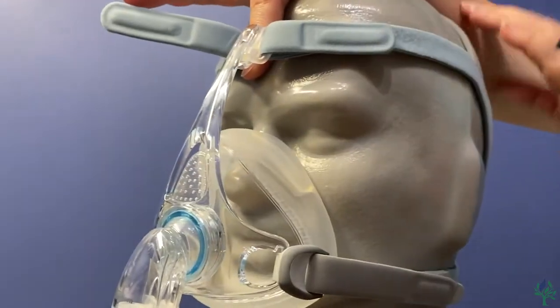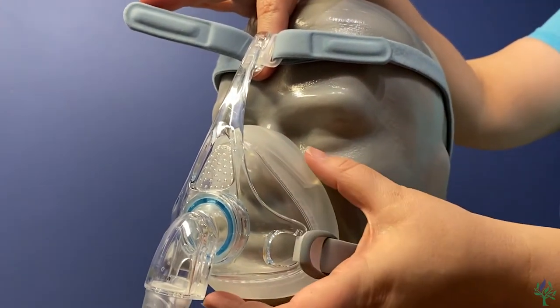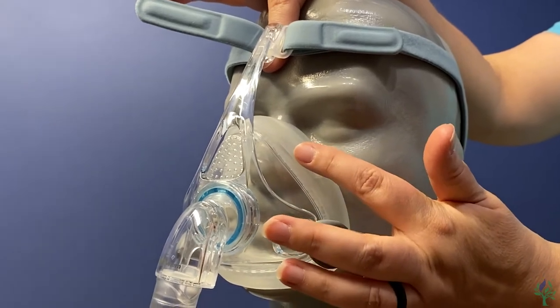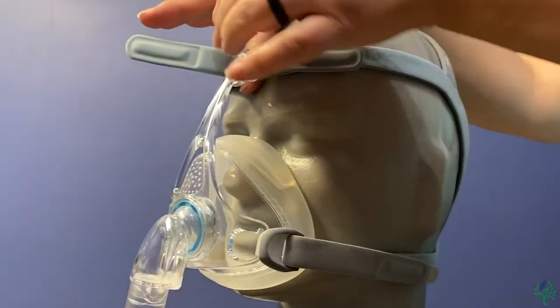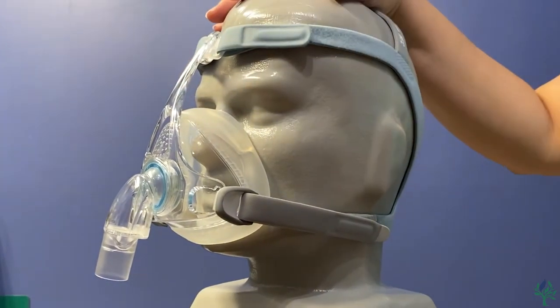You want this cushion nice and loose so that it can do what it needs to do. This piece here — that flexi fit — will actually move with that pressure as necessary. So you don't want to over-tighten; you want to allow it to do what it needs to do there.